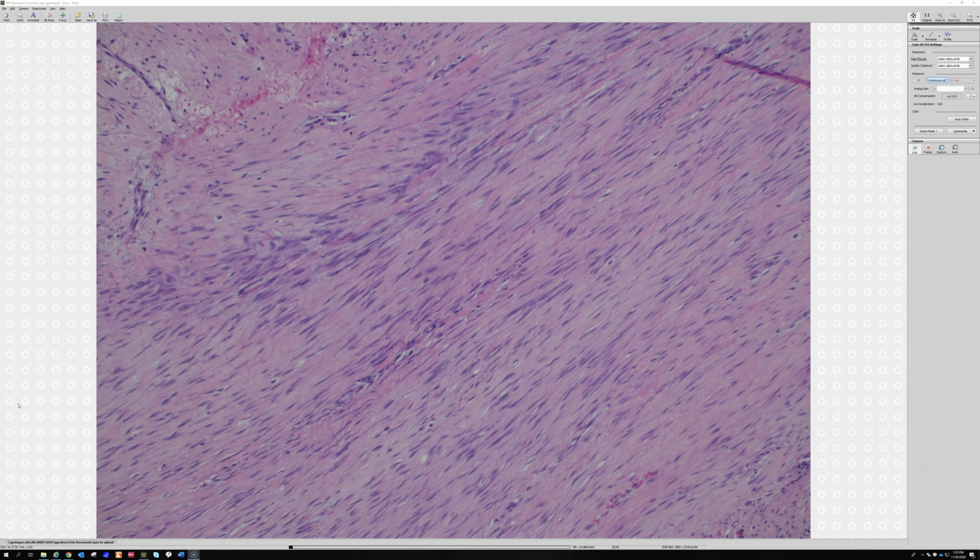I've seen a fair number of these that have scattered desmin, and even a couple that had quite a lot of desmin, but the way they looked, they looked incompatible with a smooth muscle tumor. As a general rule, expect that desmin is usually going to be negative here. But myofibroblasts sometimes do have some desmin expression, so it can sometimes have that.